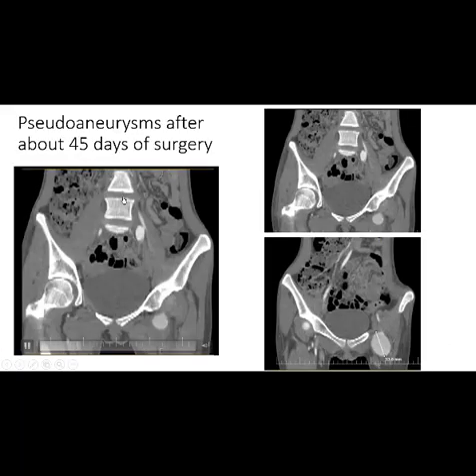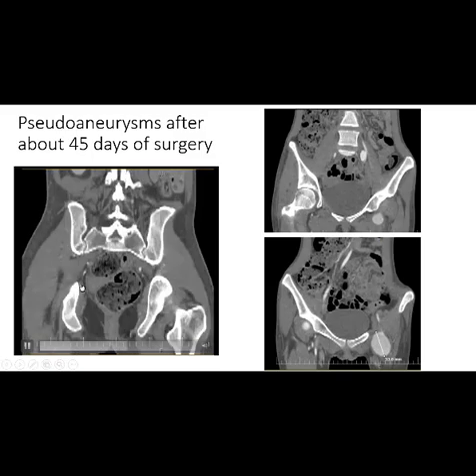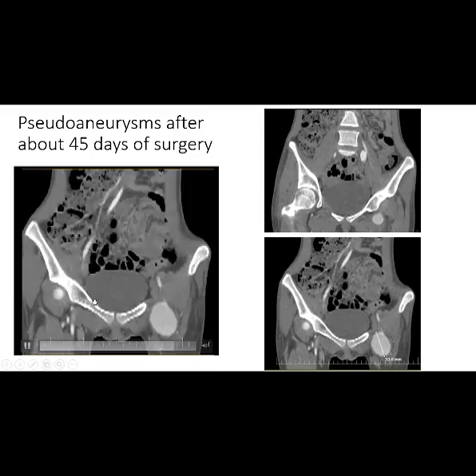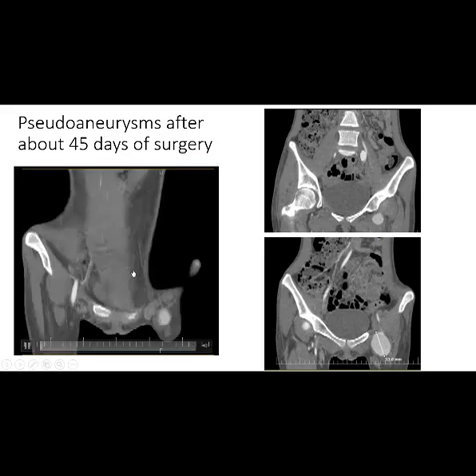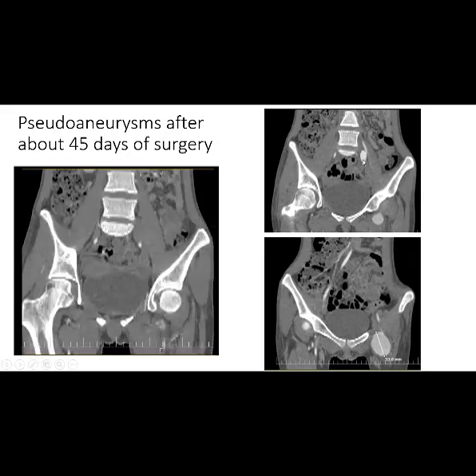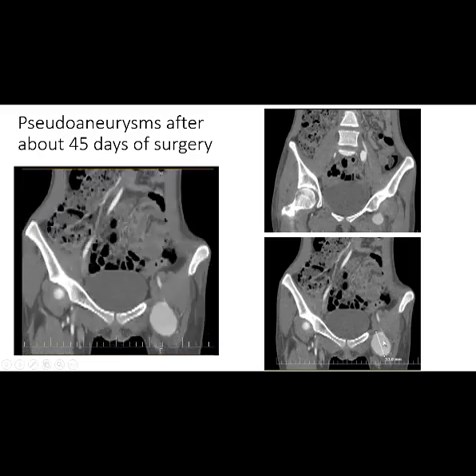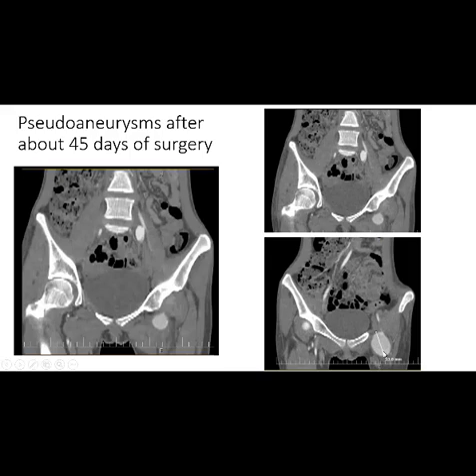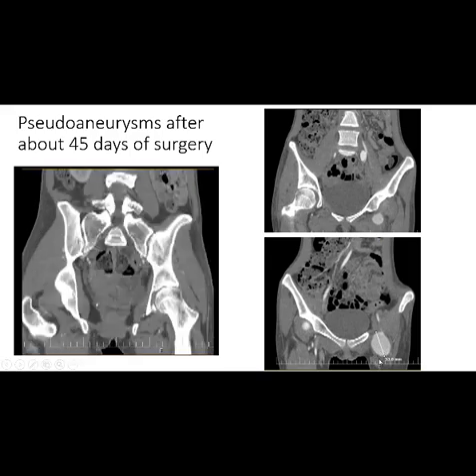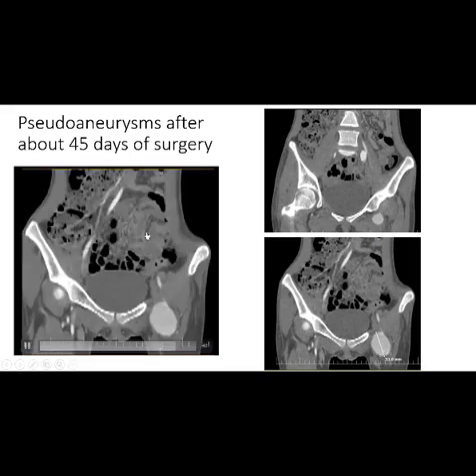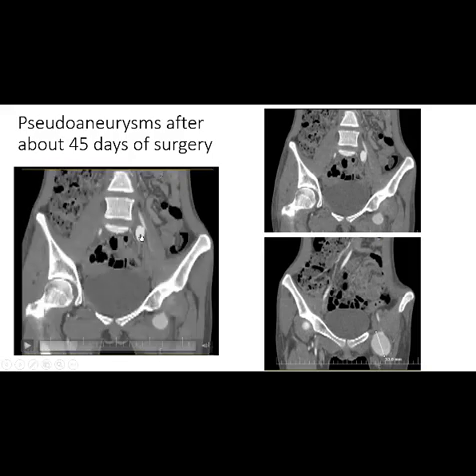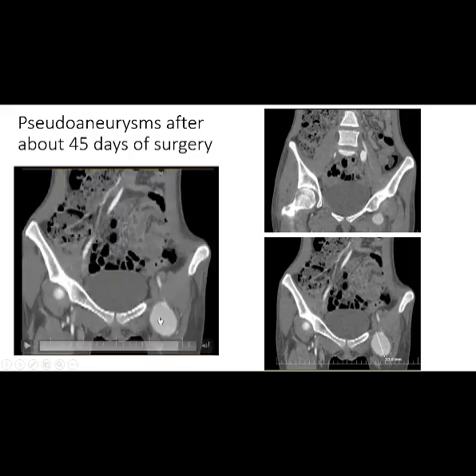After about 45 days of surgery, CT angiography showed formation of mycotic aneurysms in these arteries. You can see that the occlusion of the internal iliac artery has changed to a mycotic aneurysm, and the occlusion at the groin has changed to a large mycotic aneurysm of about 5 cm. You can see the mycotic aneurysms — that's the internal iliac artery aneurysm, and this is the large mycotic aneurysm at the groin of the patient.